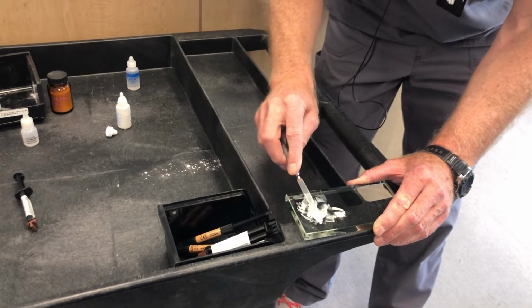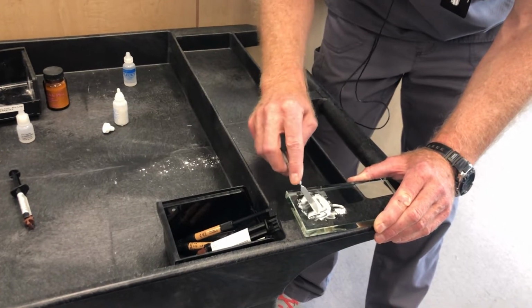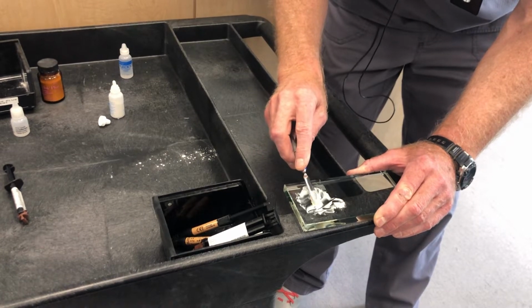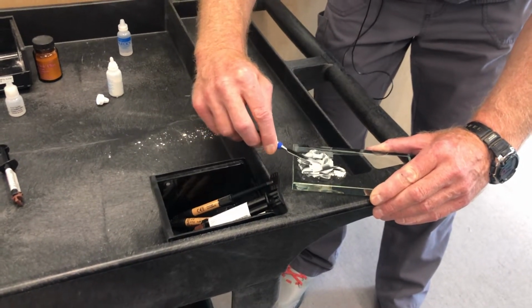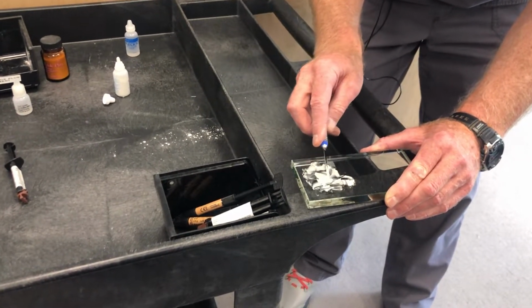So I've added some of the powder. Make sure you get all of the powder incorporated, or you'll have chunks in your cement, and whatever you're seating won't seat all the way. So I'm not getting an inch, am I? Bunch it up. It's not an inch, so we're going to add more.